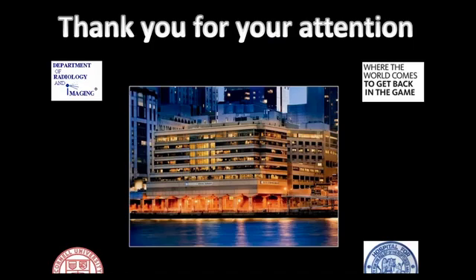One question is: thanks for the lecture, what is the role of in and out of phase imaging in spine imaging? Is it reliable for you? Sorry, that wasn't the first question, it's the second one, but I'll take that one. I like in and out of phase imaging for marrow problem solving. It's done as a gradient sequence. It takes less than 2 minutes.